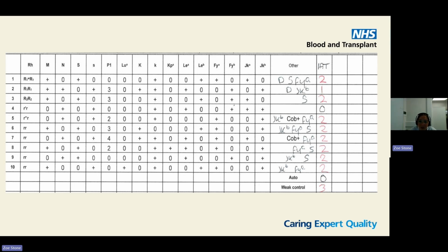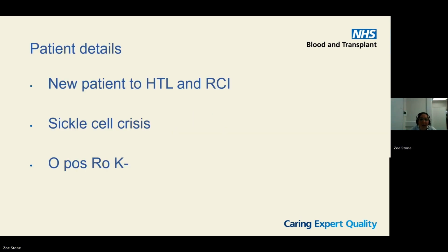I think we had to get some donor cells from our testing lab to get our 2 examples of each of the antibodies, and cross-match was provided. And that is the first example that we had. And my second example will be a little bit more straightforward.